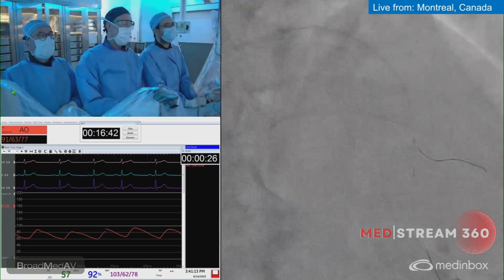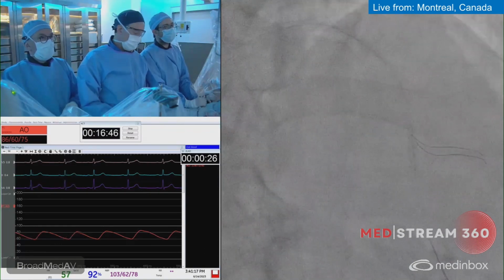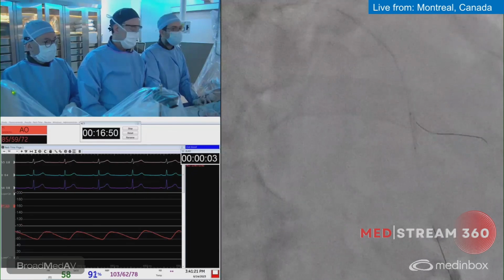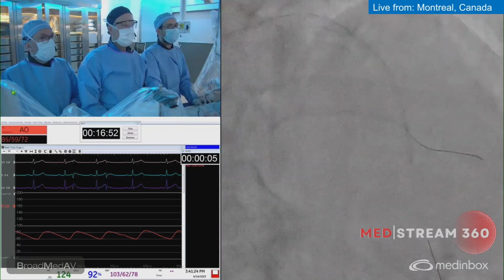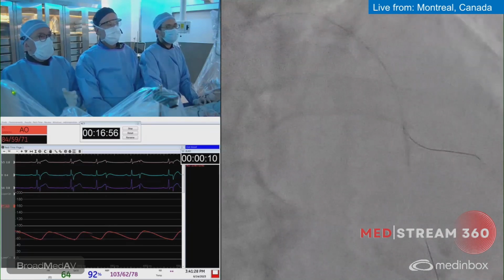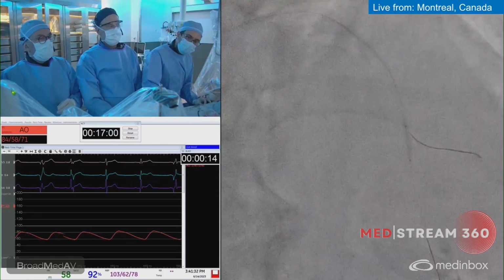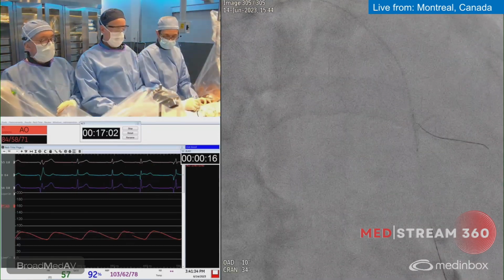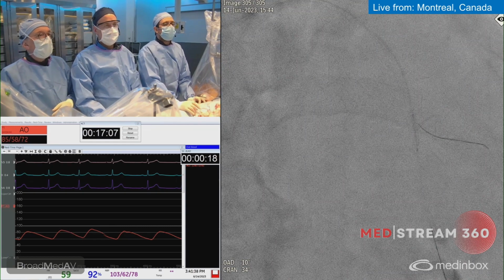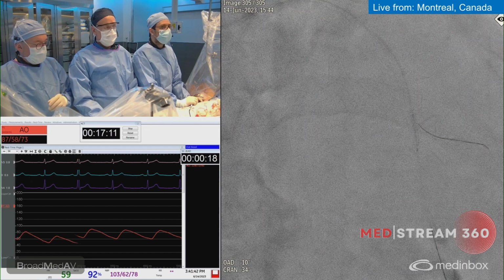And yeah, on. So here's going to be a bit boring because we're going to do this procedure. So I'm at 8 atmospheres now. He was going to do the shock wave. We're going to do that, 4 or 5 times? Yeah, exactly. While we're there, at some point, to make sure we have an influence the most we can on the vessel, and then after that, I think either we decide to stent or we go with IVUS. But I think for sake of time, also, if we see the result is good, I mean, it would go stent.